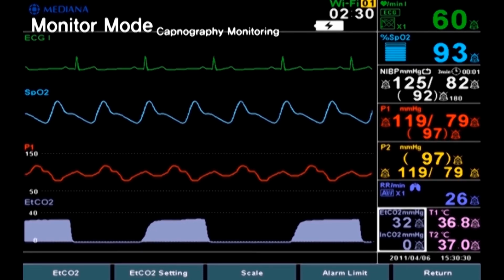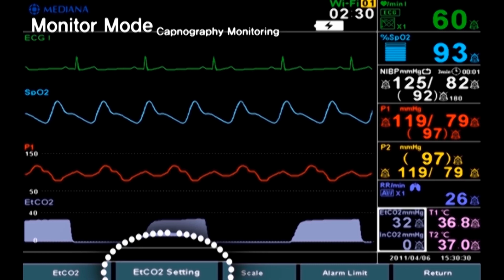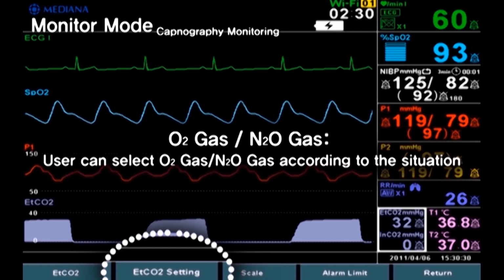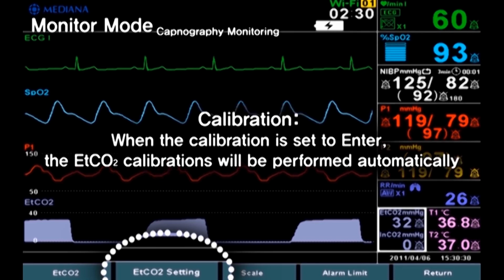Number 2. In EtCO2 setting, O2 gas, N2O gas, calibration can be changed. O2 gas, N2O gas. User can select O2 gas, N2O gas according to the situation. Calibration. When the calibration is set to enter, the EtCO2 calibrations will be performed automatically.